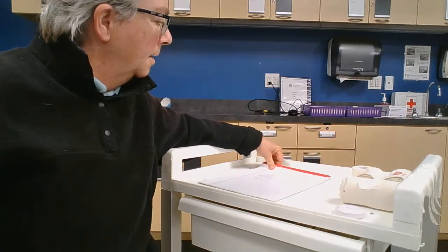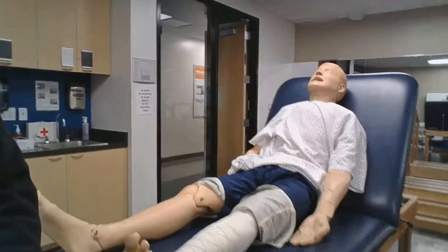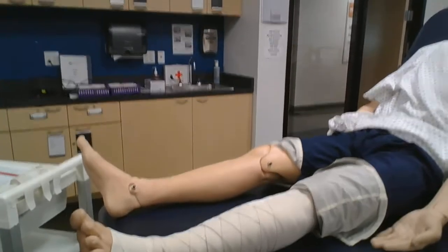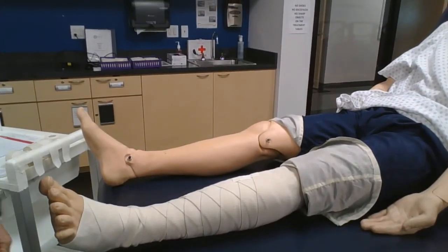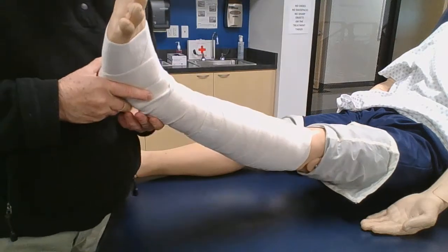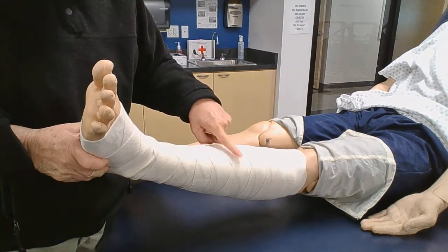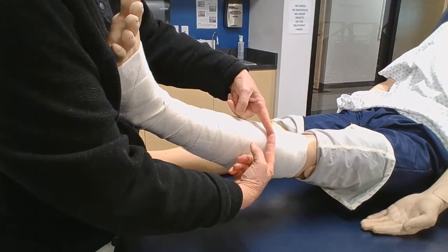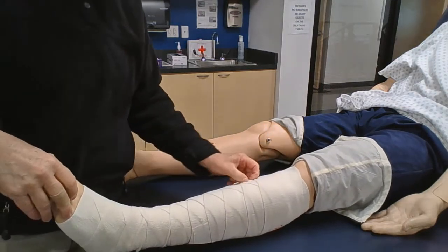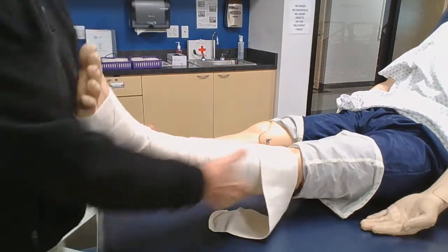All right, so let's take a look here. Joe is here with us again today, being a wonderful patient as usual. Hi, Joe. Okay. Let's get you guys set up so you can see Joe here. Okay, so I wrapped Joe's lower extremity here, as you can see. Another wrap where you can see that there. We've again got that nice cross hatching at the same location all the way up, okay, showing a good figure 8, okay. All right, so I'm going to take that off, just so you can see that, and talk to Joe a little bit here.